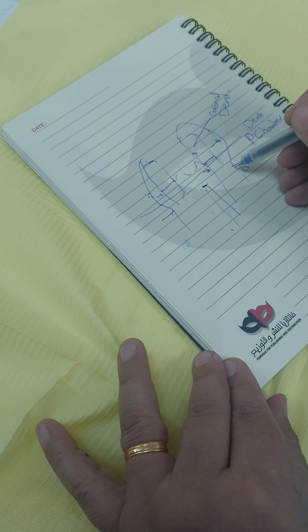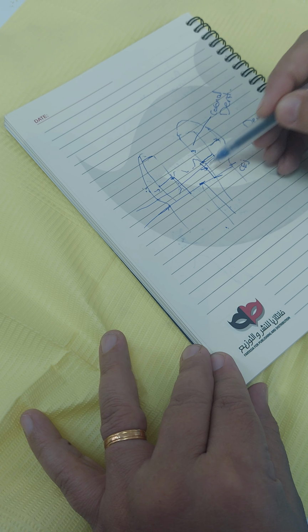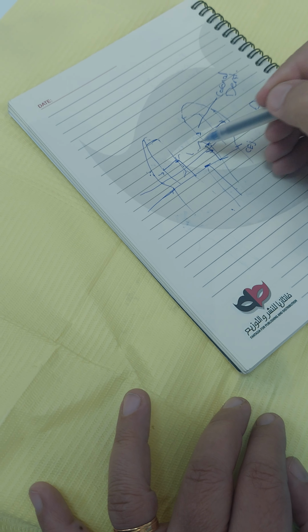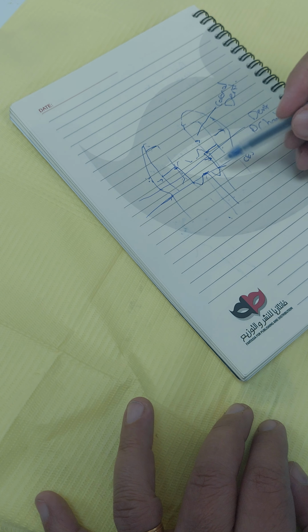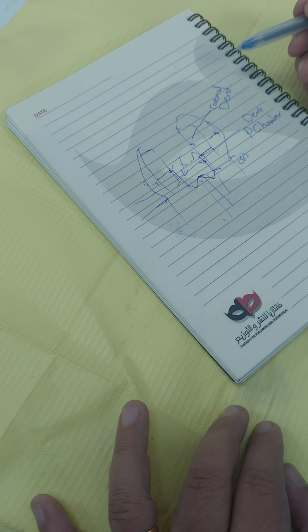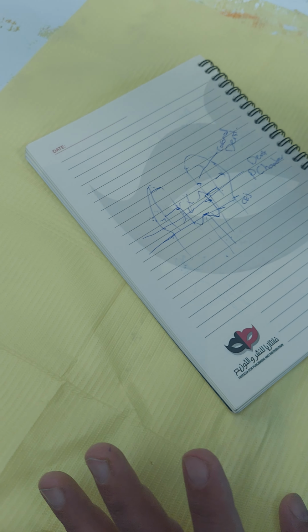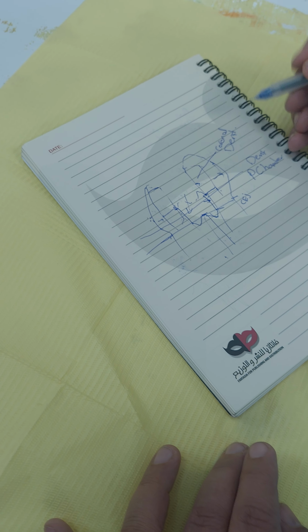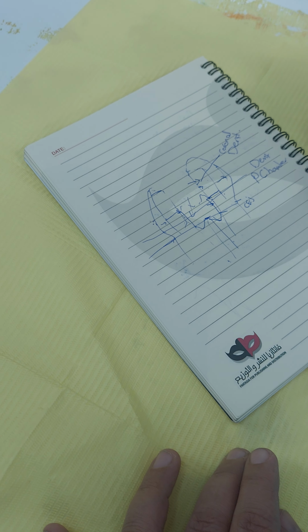And this is why I'm recording this video. I want you to notice that this is dentin around the chamber, and this is the dentin that will cause us to decide if we're going to place anything as a core here, with minimal posts, like semi-posts going in. This is when we go to a composite core, and we're going to the decisions of amalgam core when we had amalgam and so on. Okay, so this is the dentin that decides this area. There is another dentin that causes the coronal. This is the dentin of the coronal.